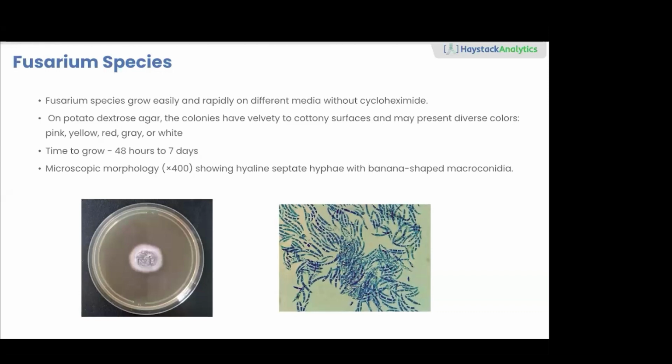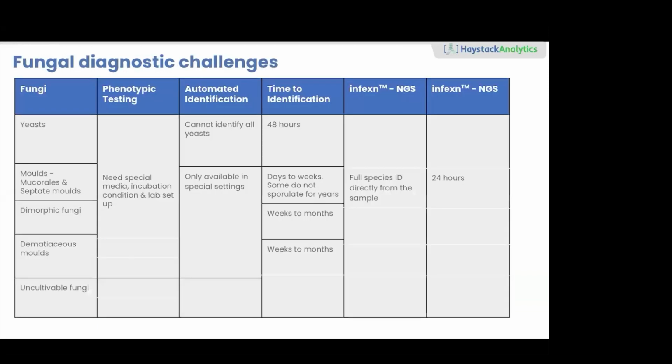So having said that, from a very basic microbiology point of view, what are the diagnostic challenges a microbiologist faces? Most of it needs special media, proper incubation conditions, a lab setup, and a dedicated technician. Sometimes certain molds can be so difficult to even sporulate, and a lot of their identification relies upon the microbiologist's skill, experience and expertise in interpreting these molds. And the problem with the automated identification that is available is that it cannot identify all the yeasts.